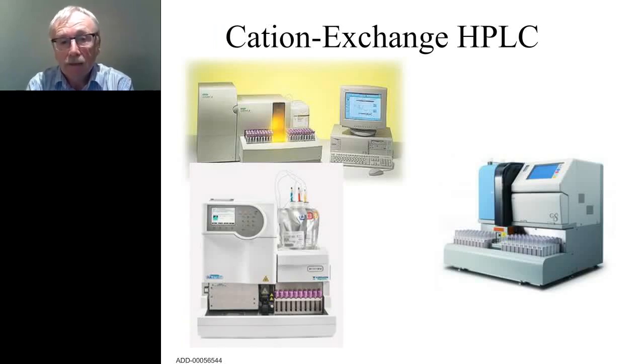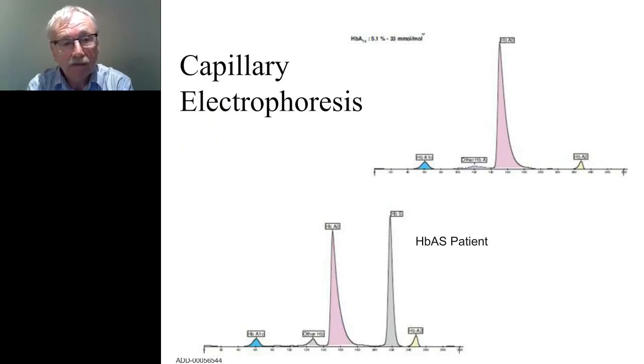There are a large number of HPLC methods that are described, and this is probably the longest used method group in clinical medicine. Capillary electrophoresis, relatively new, used the same method principle of charge separation, but in a capillary rather than on a column.